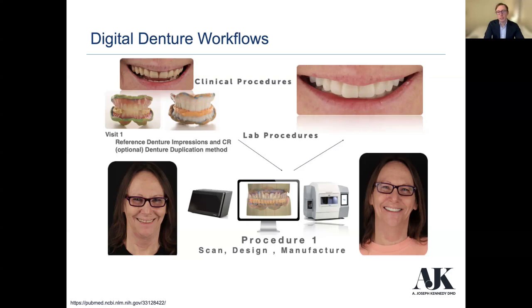So in theory, 2 visits if you're doing someone that already has a reference denture or an existing denture to a new denture. And the nice thing, as I mentioned before, is once they're happy, let's say the patient's just thrilled with how this one looks, you've got the digital file there. So, hey, I lost this, or I broke it, or I dropped it and a truck ran over it, or whatever the crazy things that you hear in your office every day. It's one of those things that, okay, no harm, no foul, Mrs. Smith. We'll get you another one printed or milled and have it here for you. And this is what the fee's going to be.